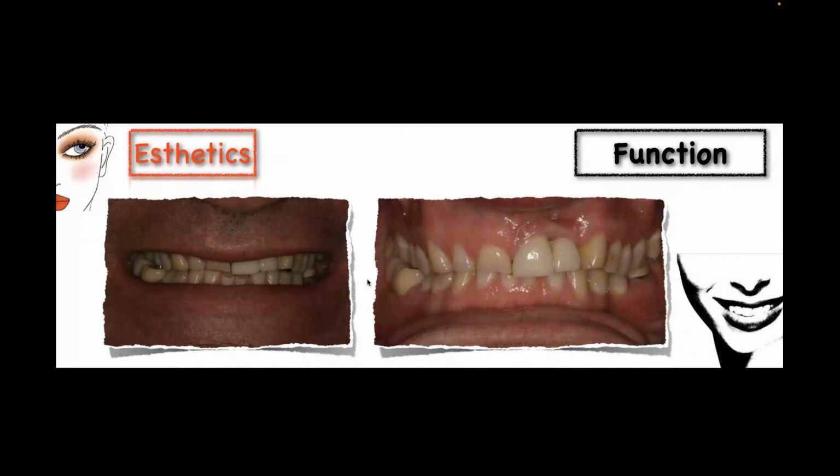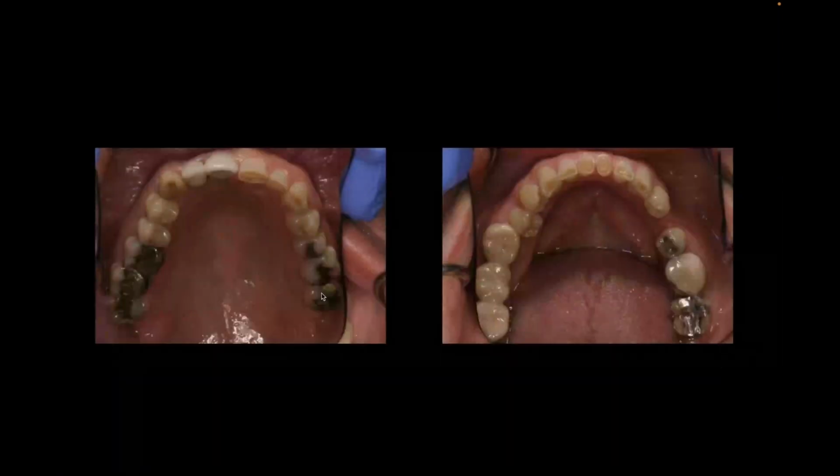And in these crazy complex cases, you know, this case is presented as an aesthetic case. It's an old case, so please forgive the photography. It's not mine. It's a pretty old case. But the point of it is, right away, I can look at a case like this and say, okay, we're changing the OVD, right? We're going to have to get away from all the functional wear that this patient has gone through. And the only way you're really going to fix that is by changing the position of the teeth.